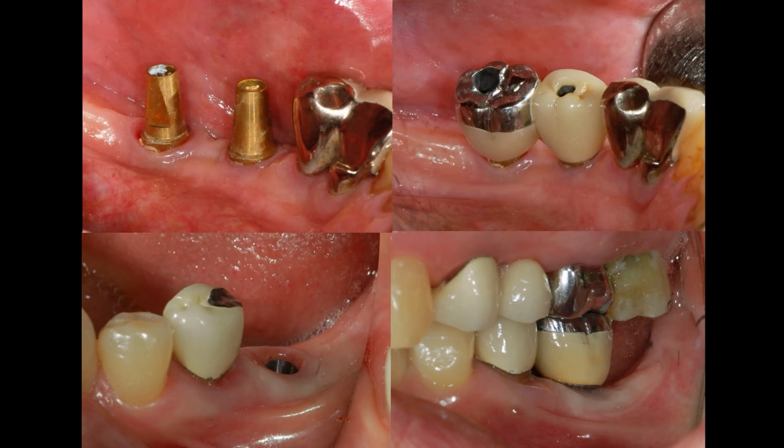In this case, because it is posterior area, you need to explain well to the patient, provide supragingival prosthesis, and form embrasure. This is the kind of prosthesis design where maintenance can be done and inflammation prevention can be done.